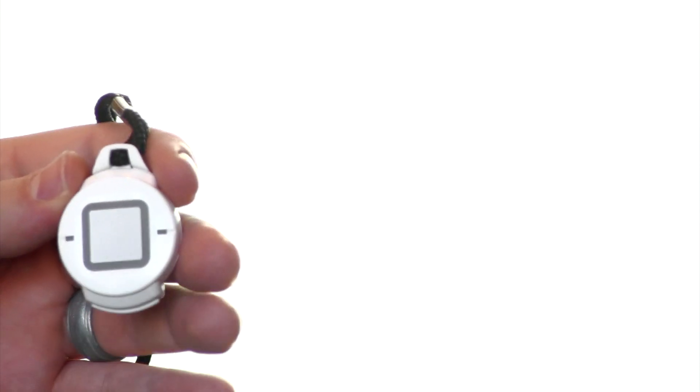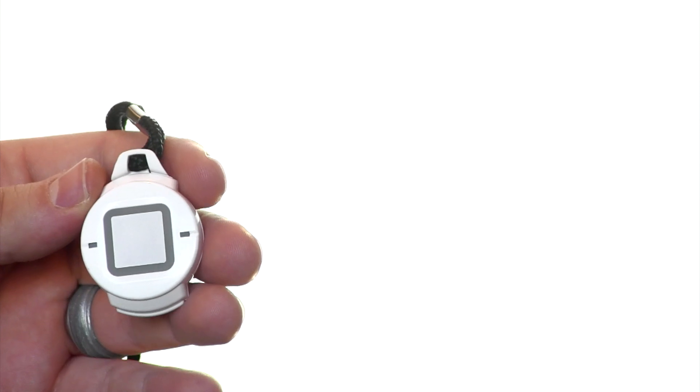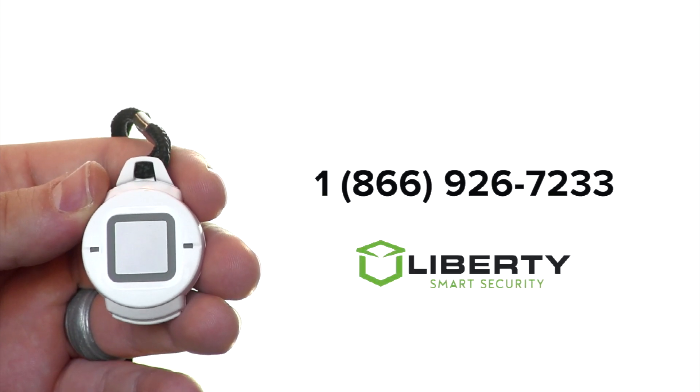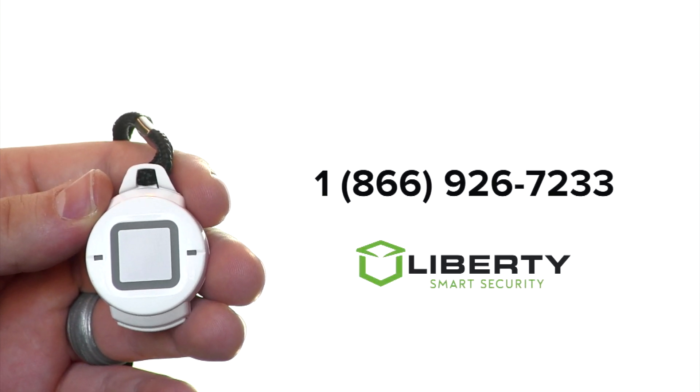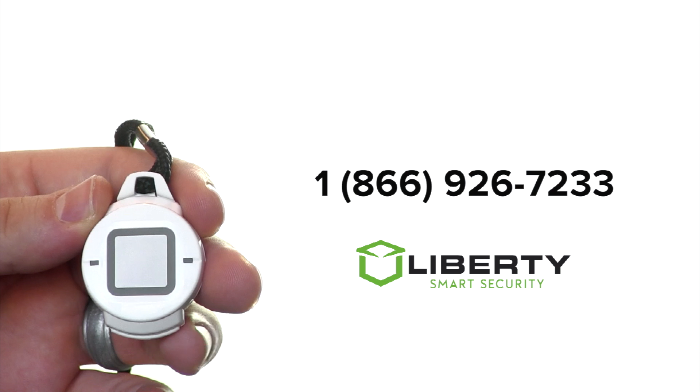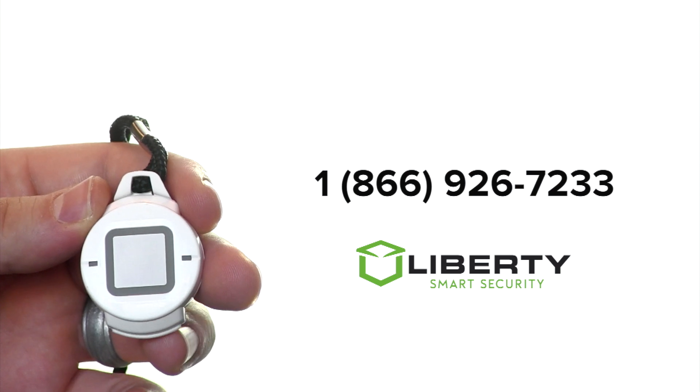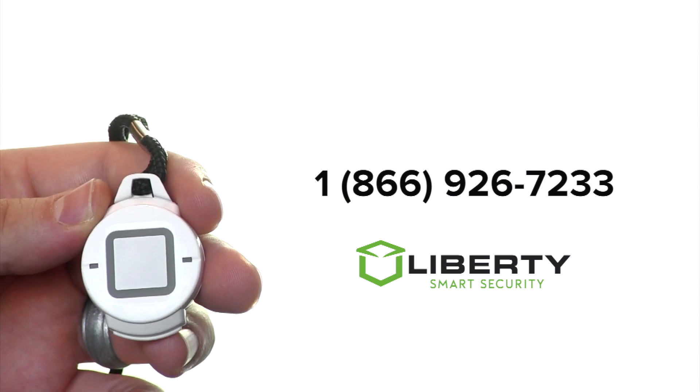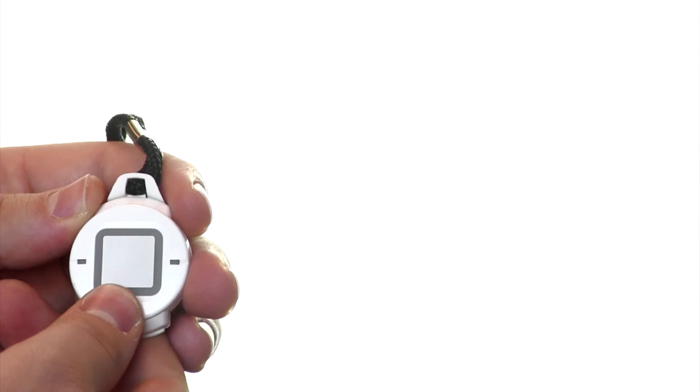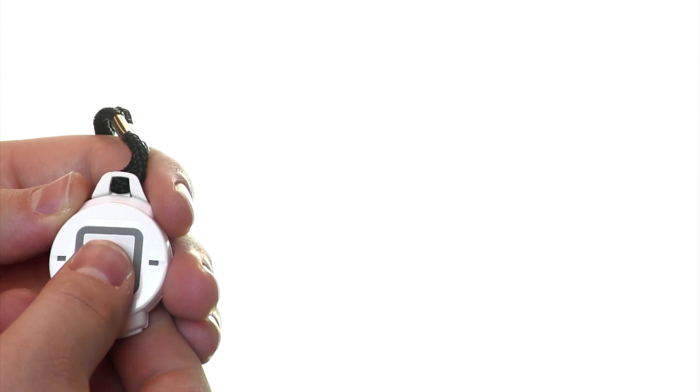It is important to test this device. To do this, you'll want to call in to Liberty Security and have your system put on test. From there, an over-the-phone technical support agent can assist you in testing the signaling from the device by pressing and holding the square button.